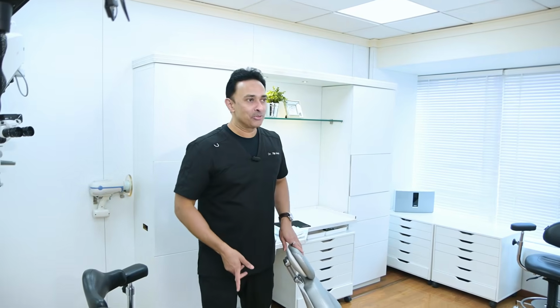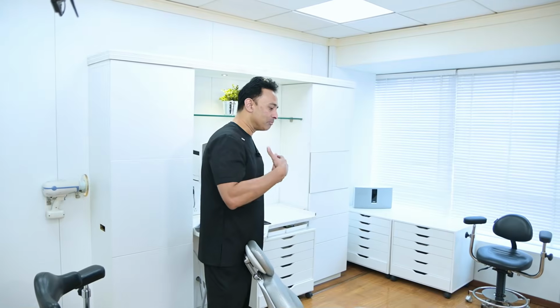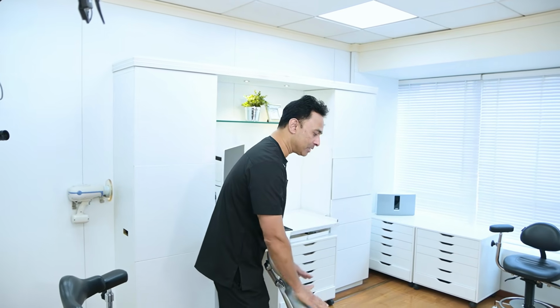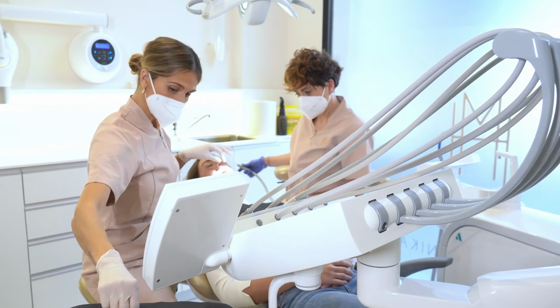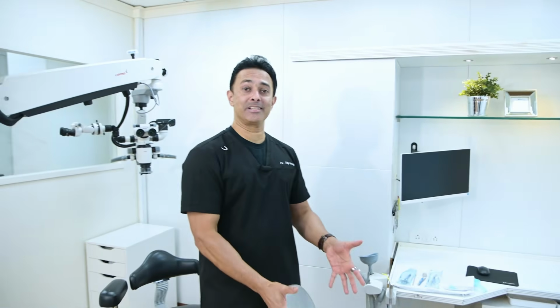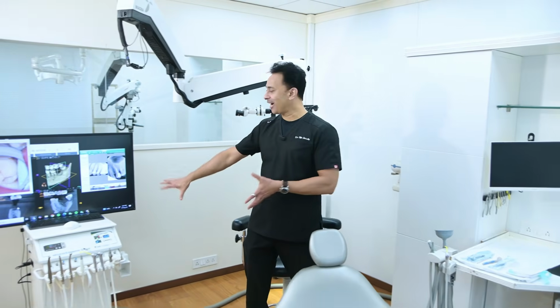And then the fourth reason, of course, is we don't have a chair-based arm. So most typical clinics tend to have an arm-based operatory where the arm is attached to the dental chair. And then when you bring it across, the patient is kind of boxed in there. So you have this kind of an appearance that somebody is going to be caged inside during treatment. That adds to anxiety. What we have is a cart-based operatory.